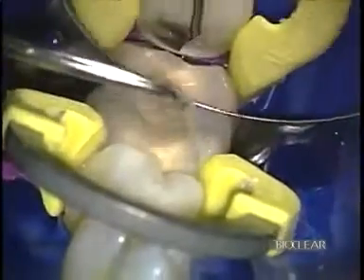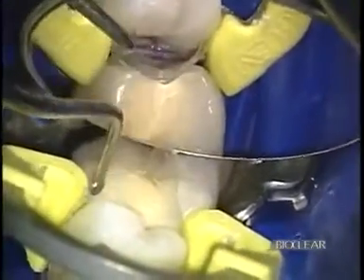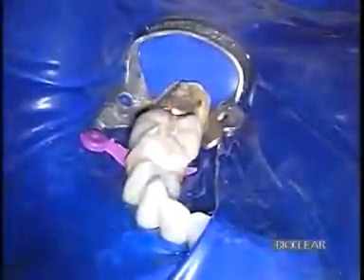One of the nice things about using these new separators is that you can actually shift the matrix because the separating ring provides tension. You can take an instrument and aggressively pull the matrix to close a difficult contact. Once the separating ring is removed, you will need to light cure again because the separating ring blocks the buccal lingual curing.